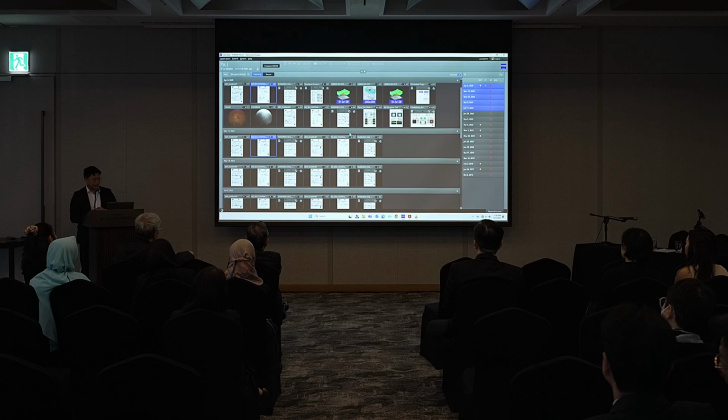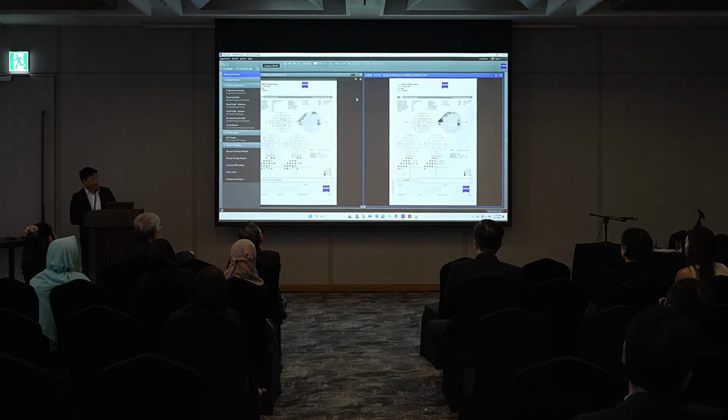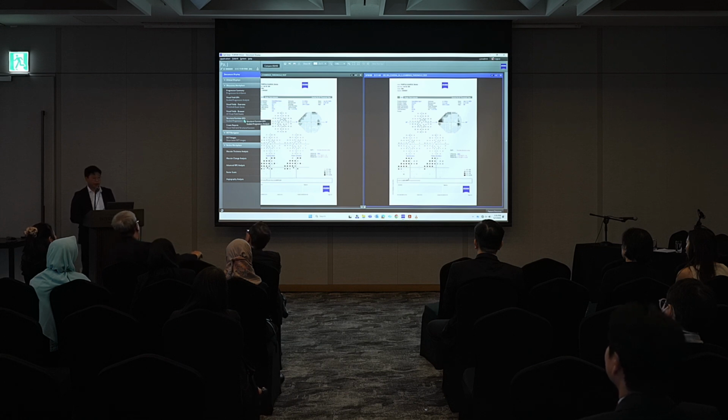Now, basically, is this patient getting worse in terms of their glaucoma? Here's a 66-year-old guy, and we've got a nice little video to share, but he's been sent because he's had previous glaucoma surgery, so he had a PreserFlo microshunt. And the concern was that initially his pressure was doing well, pressure was 12, but now this poor gentleman has a pressure running in the 20s, and essentially we're concerned that the glaucoma surgery has failed.